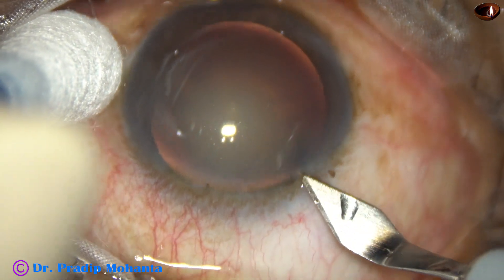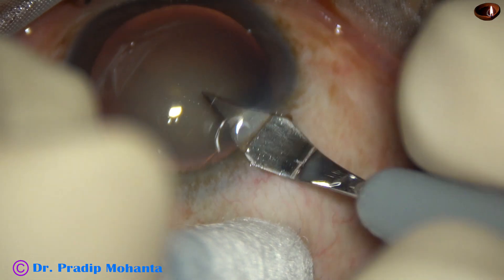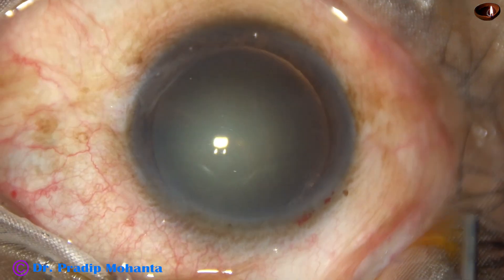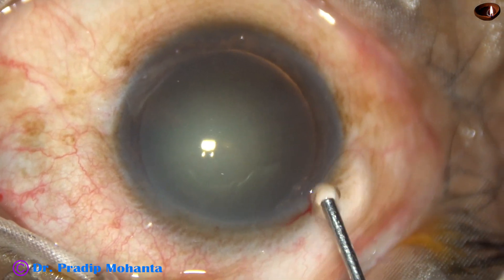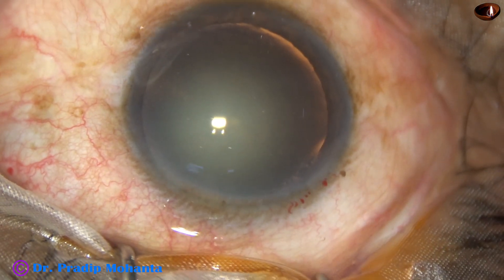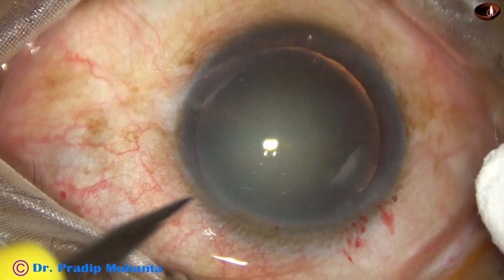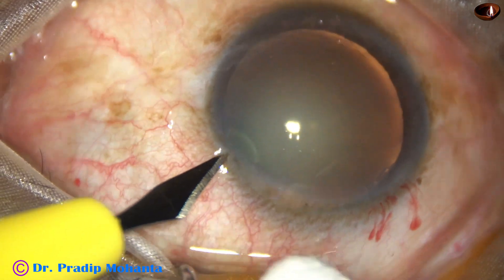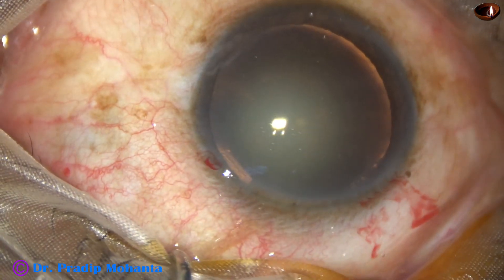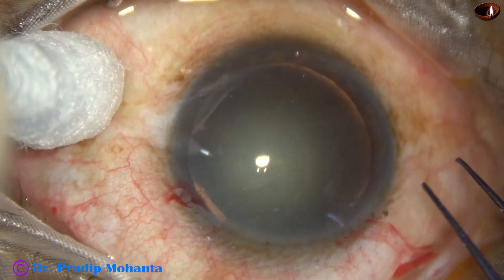This is the main incision with a 2.8 mm steel keratome on the posterior aspect of the limbus. The anterior chamber is filled up with 2% hydroxypropyl methyl cellulose. A side port is made on the left side of the main incision, about 3 o'clock hours away, with a width of about 1.8 mm so that a 23-gauge Simcoe can easily go in.